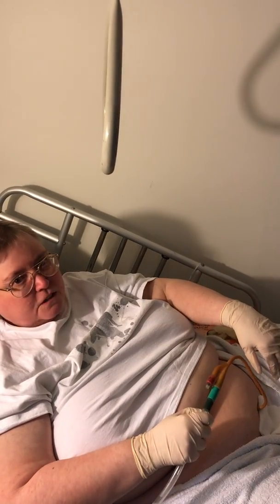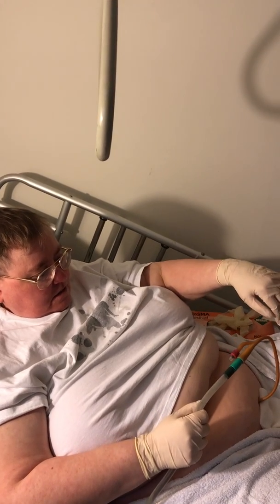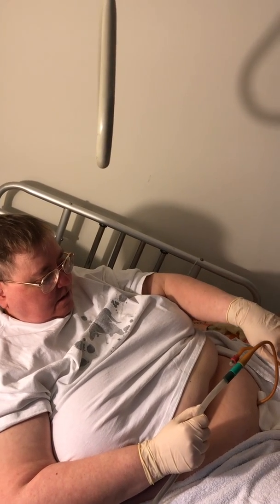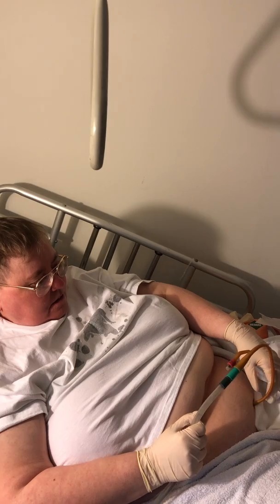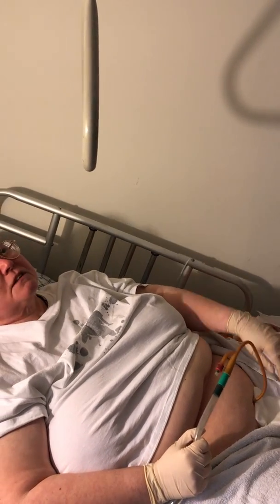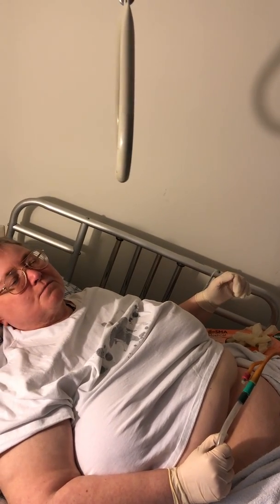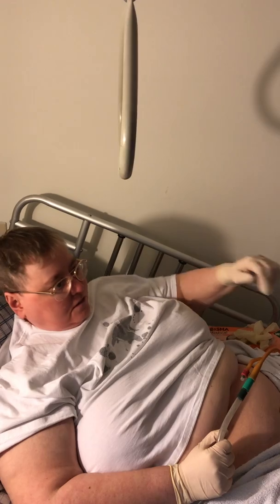So, are we ready? You need some iodine. I'm sorry. Oh yeah, we've got to clean it. Yes, we do try to do a sterile prep. I'm a little goofy today, excuse me.